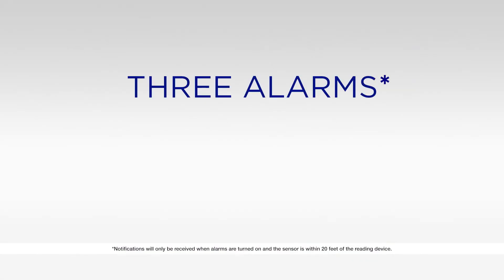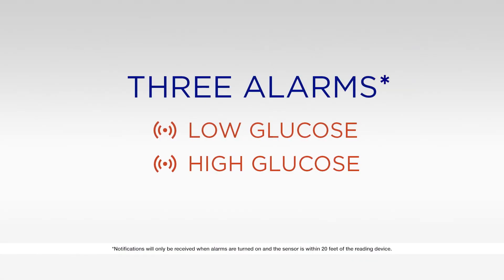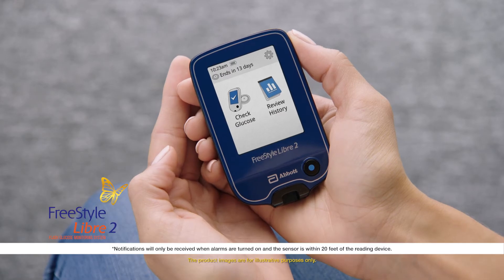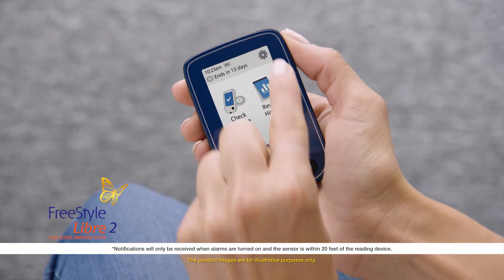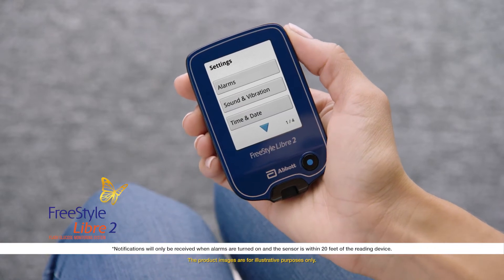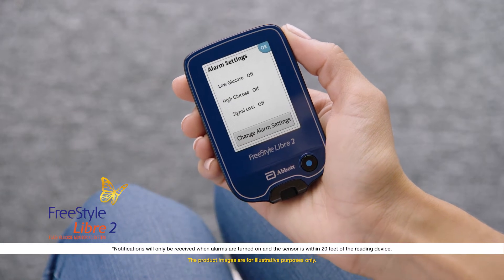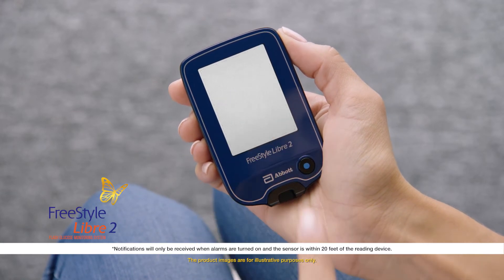There are three real-time alarms: low glucose, high glucose, and signal loss. Go to the home screen and touch the gear in the top right corner to get to settings. Next, touch alarms, and then change alarm settings. Then select which alarm you'd like to set.